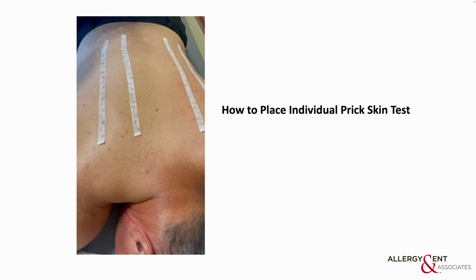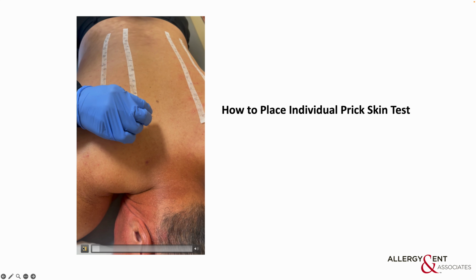You don't want to fill too much either, because when you fill too much, liquid will drip everywhere and it can make a big mess. When you skin test, you have to push down the prick firmly on the skin of the patient. You can do a single prick or multi-test here, and the pressure should be the same for either test. You do not want to break the skin. There should not be bleeding here, but you want to make sure you push down firmly enough to create a small impression on the skin. Okay, so let's watch. This is how she does it, and I think she did a good job.